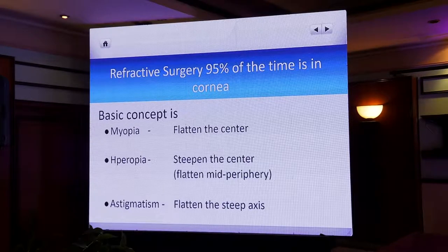You can use any laser. People will talk about so many different things, epiLASIK, iLASIK, God knows what. But there are only two basic lasers. One is the excimer laser, which is used for all the different types of LASIK and PRK. And nowadays there is the femtosecond laser, which is used for SMILE. It's called ReLEx SMILE. We'll talk a little bit more on that.